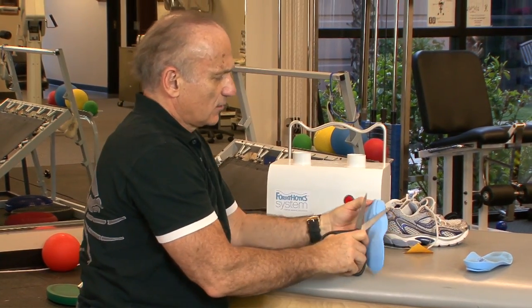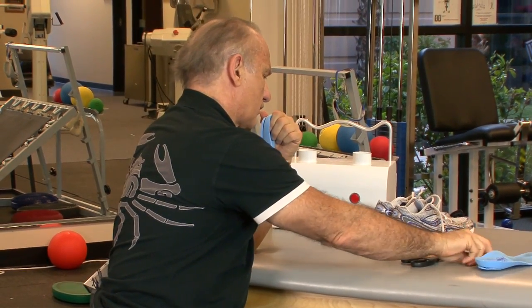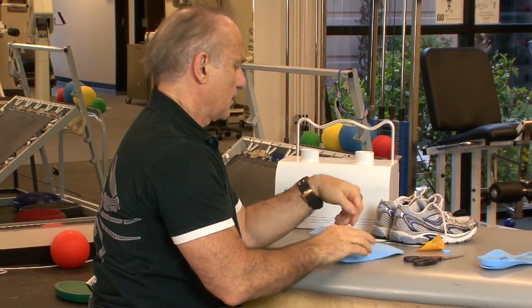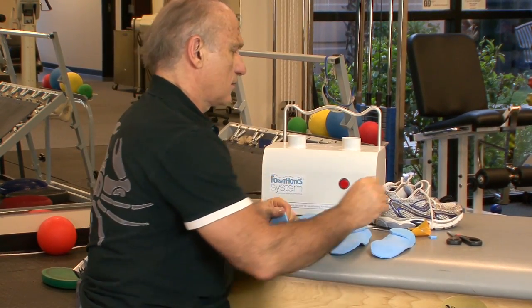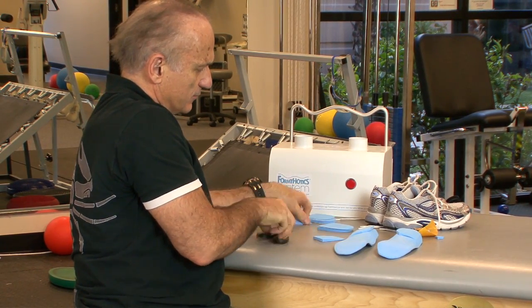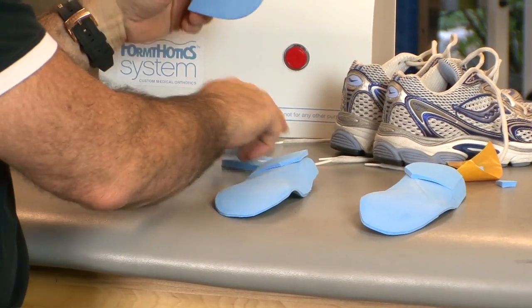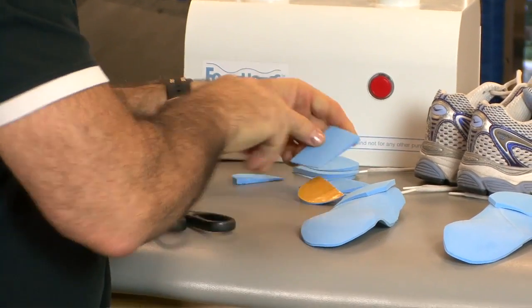I'll do the same thing with the second wedge — trim this off. We do have a grinder we can use to grind off any point the patient might feel when standing on the orthotic. Because of the forefoot instability, we could make a forefoot post by cutting off the end of the wedge and placing it on the forefoot piece, but I'm going to wait until I get Georgiana back out to determine exactly where to put it.